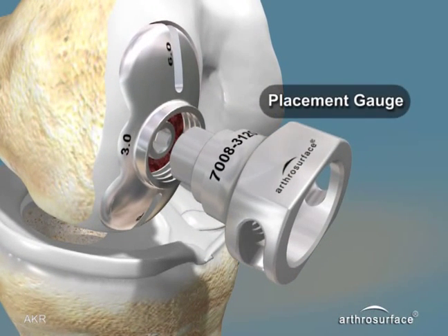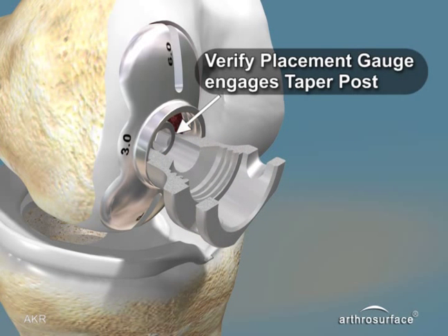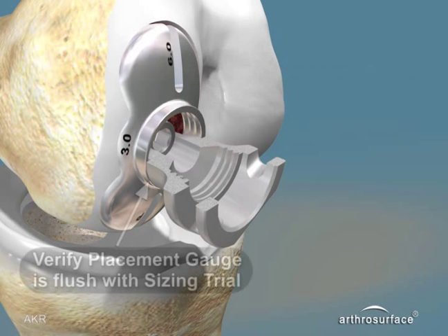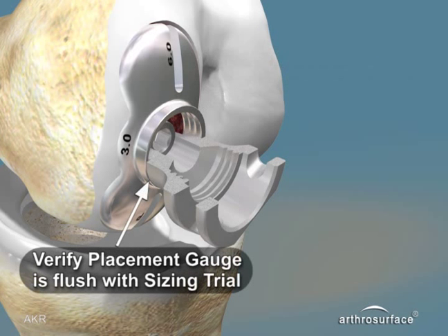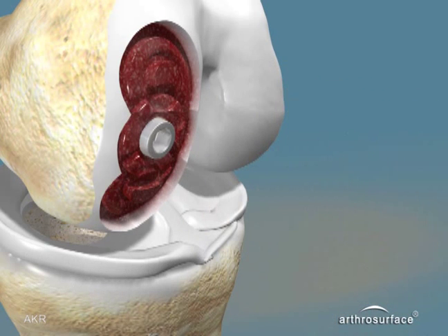A placement gauge can be used to check the depth of the taper post in relation to the femoral trial, to ensure that the taper post will engage onto the articular component. Remove the sizing trial.